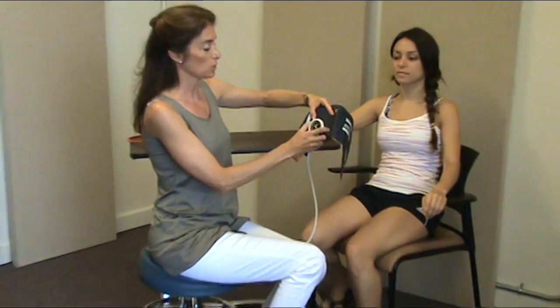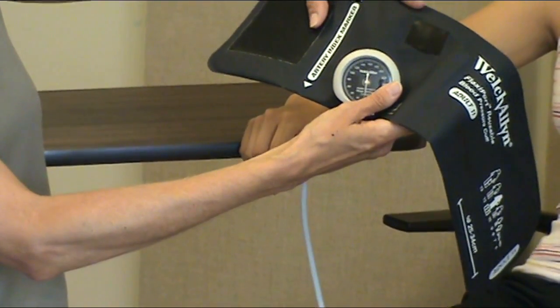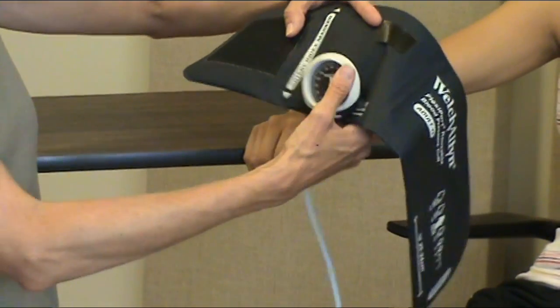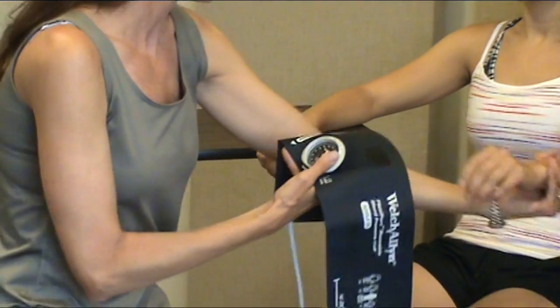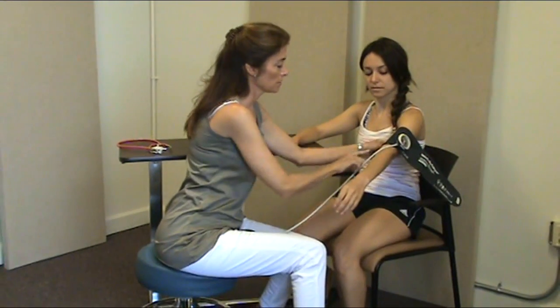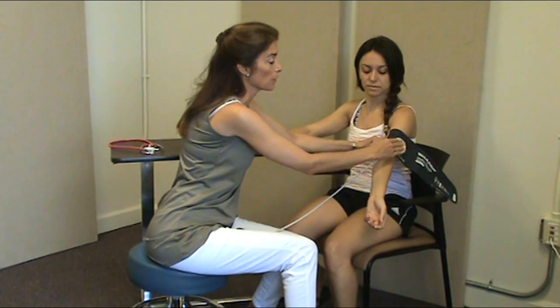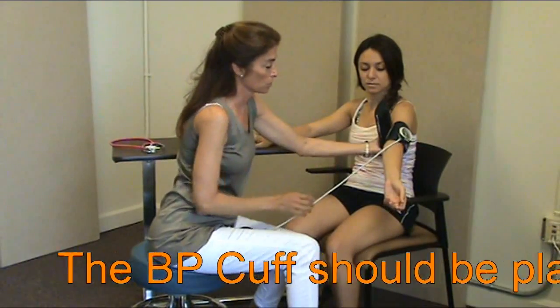So what we need to do is to make sure that when we are putting the blood pressure cuff onto the arm, the arrow where it says artery index marker is actually on the brachial artery. So for example, when it is in this position, the artery is going to be right in here, the brachial artery, and so the face of the blood pressure cuff is going to be facing laterally. And then it will be placed around the arm in this direction.